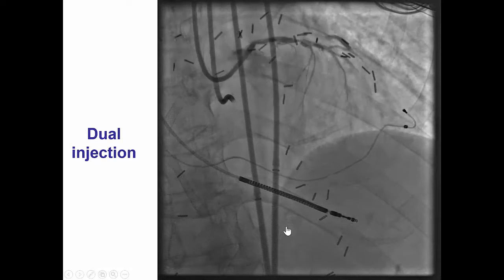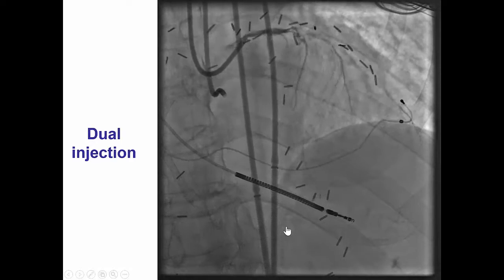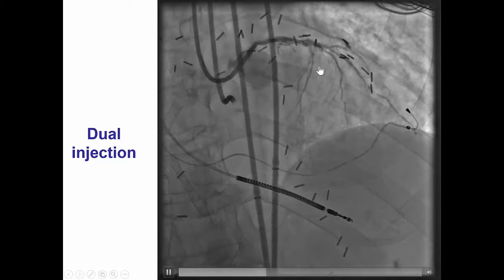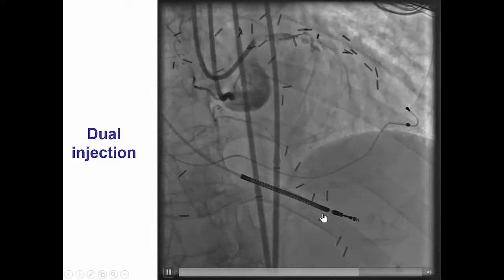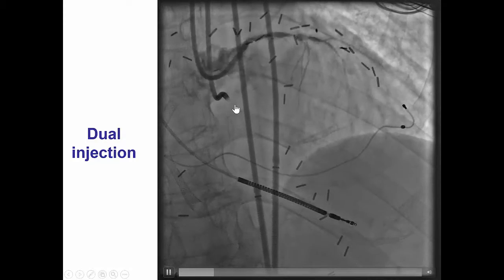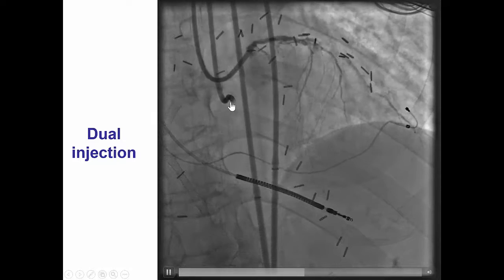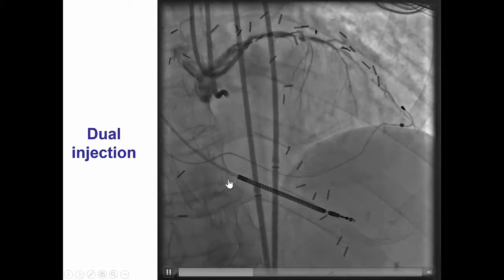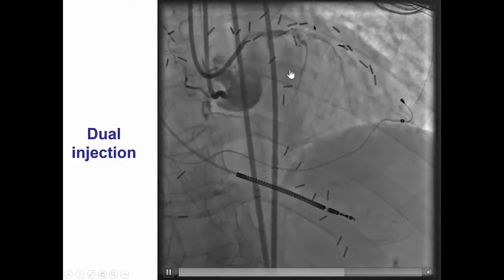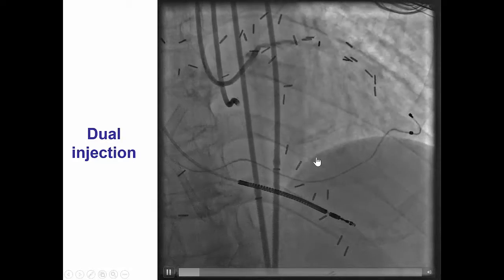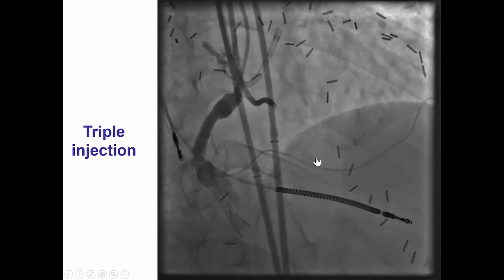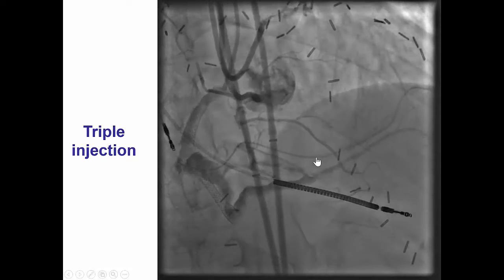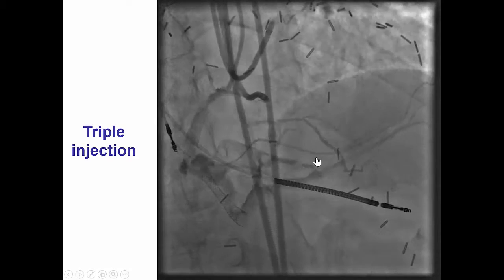To plan the case, we did a triple injection in addition to the dual injection because we wondered whether we had some retrograde access to the posterior descending artery. We knew that recanalizing the native right would have been very challenging because of the ambiguous proximal cap and the long occlusion length, and therefore the question was whether we could go retrograde. We did a triple injection because part of the vessel was filling via the LIMA graft.